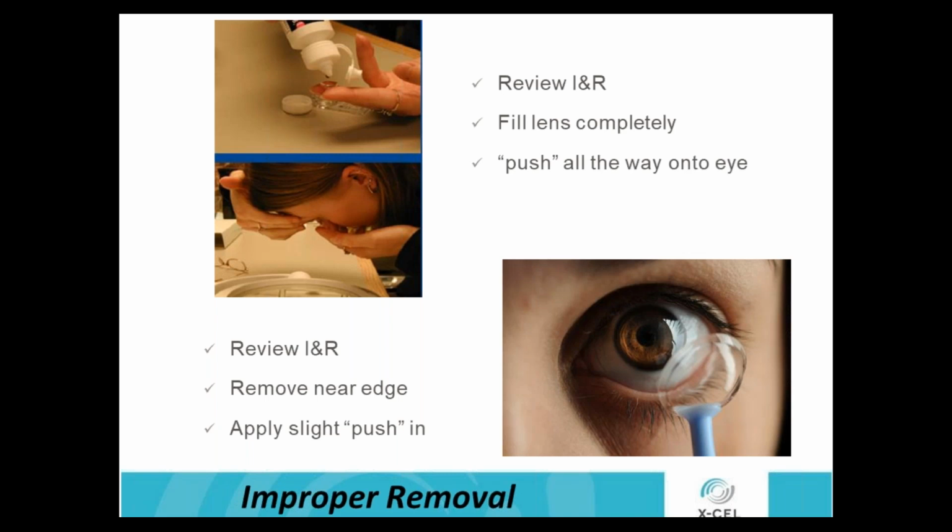The things that we see the most are patients not really using enough saline, not putting enough into that base curve or well of that lens, not overfilling it, especially if they have a reusable bottle and not a single-dose saline. If they have a reusable bottle, they'll try to skimp on that amount that they put into that lens. They will do it, I'm telling you. So we need to make sure that it's about filling it properly and not getting any air bubbles. If you're consistently getting air bubbles, it's definitely a technique, and probably 99% of air bubbles are technique.